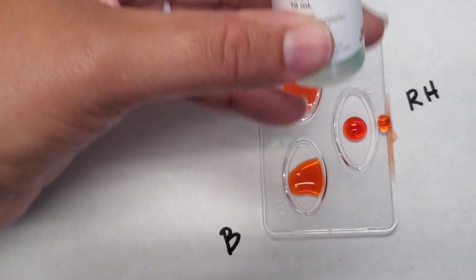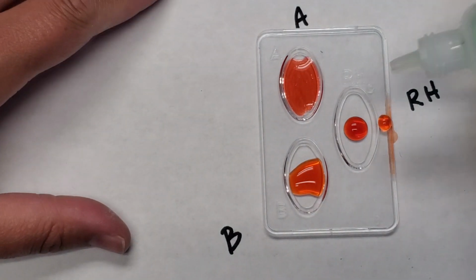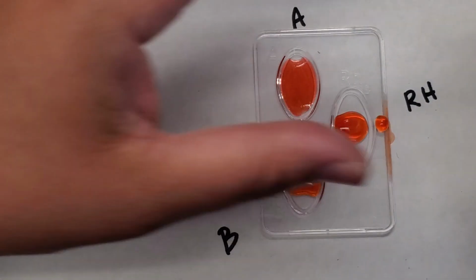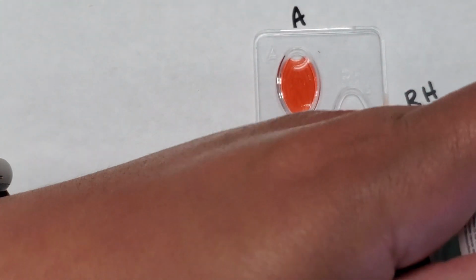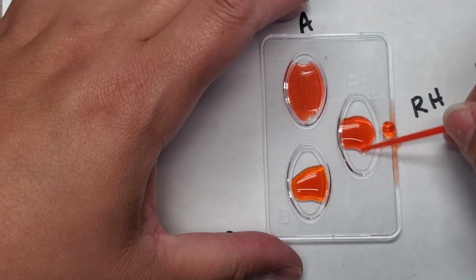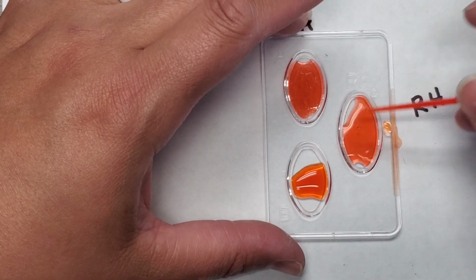The last one that we're testing is the Rh antigen. So the green bottle here has Rh antibodies in it. Again, we're going to mix 3 drops of this with the 3 drops of the blood. And again, if the Rh antigen is present on the surface of the red blood cells, that Rh antibody that we just added is going to attack it and cause it to clump. So that's what we're going to be looking for.